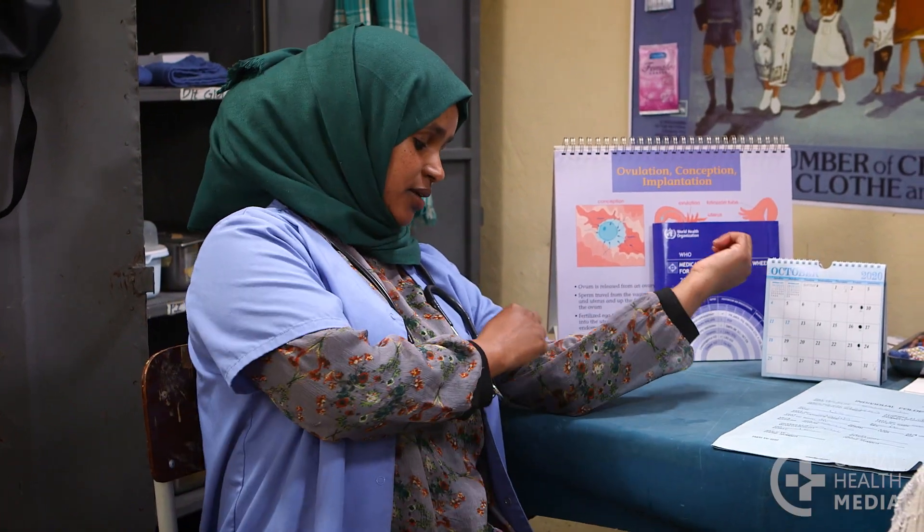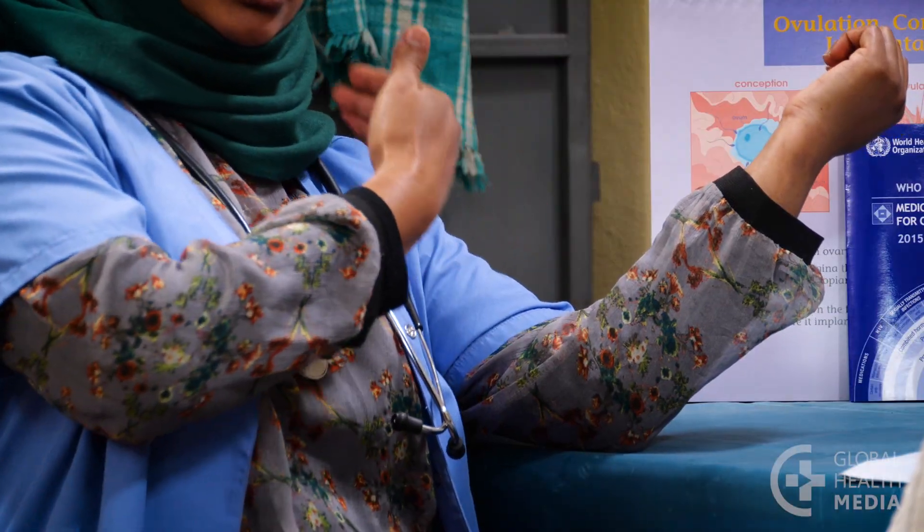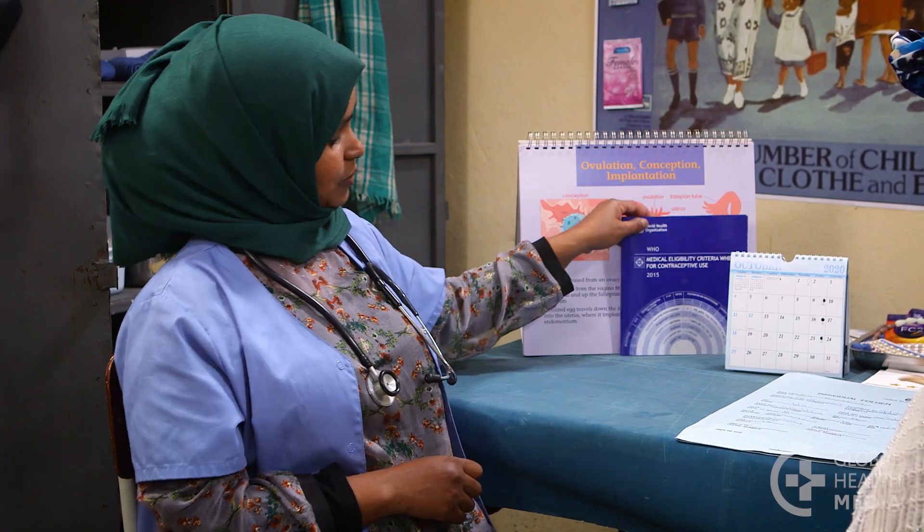Some people think that the implant will move around in their body, but that's not true. Once an implant is inserted correctly, it stays where it is until you want it removed. Your healthcare provider will ask you questions about your health to be sure the implant is safe for you to use. But it's a very safe method for almost all women, including adolescents, and it does not cause birth defects or cancer.